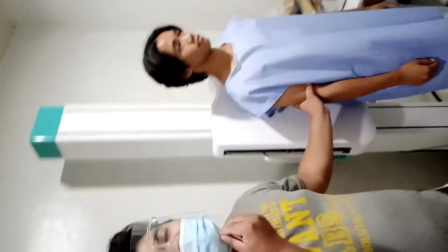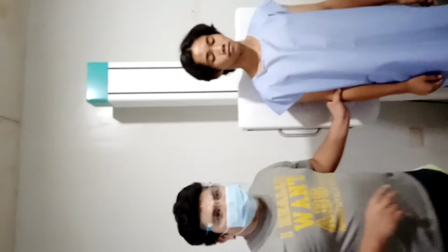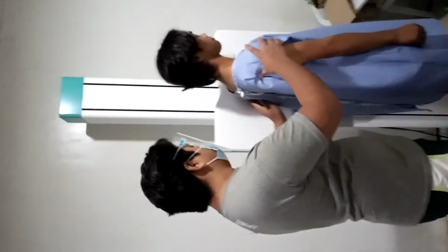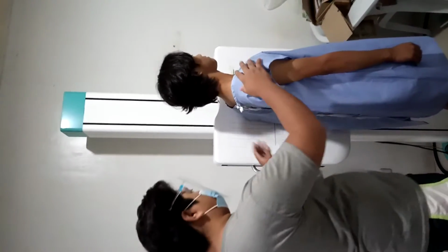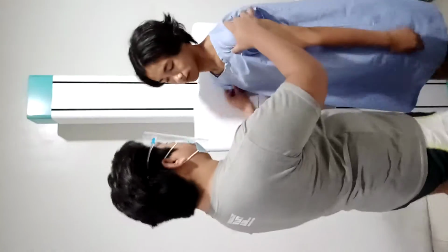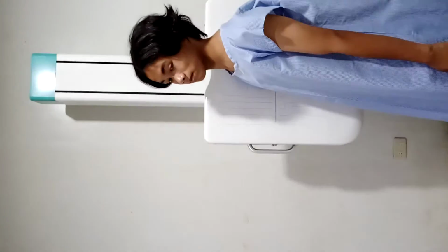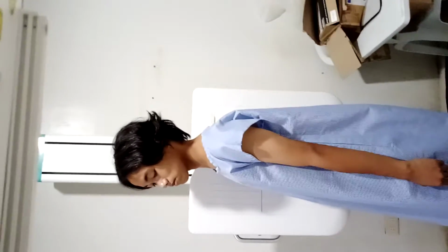In lateral position, adjust the patient's body to 90 degrees lateral, right or left lateral. Then center the patient at the coronal plane through the mastoid process to the IR. Then adjust the shoulders to a horizontal level and the body to a true lateral position.